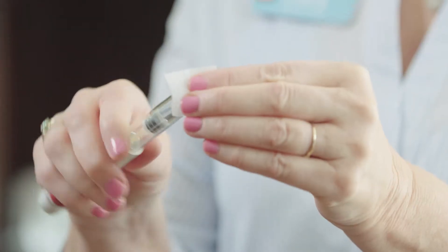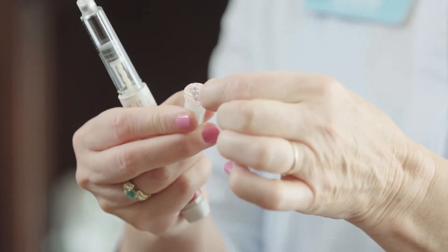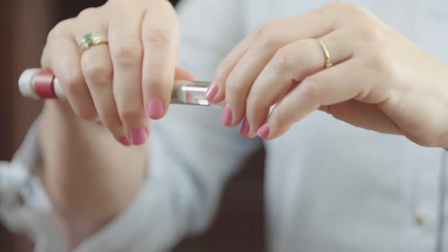Once you have your dose dialed in, you're going to take an alcohol swab and wipe off the end of the pen with the alcohol. Let the alcohol dry. The pen needles are packaged with your pen — you're just going to peel back the paper covering. That's going to expose the needle that will puncture your pen. Then take the pen needle and push it onto your pen, screwing it on tightly.